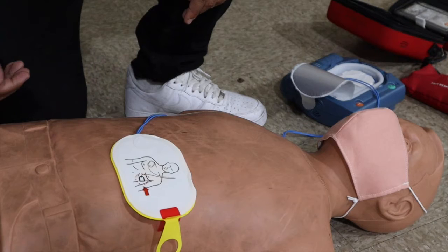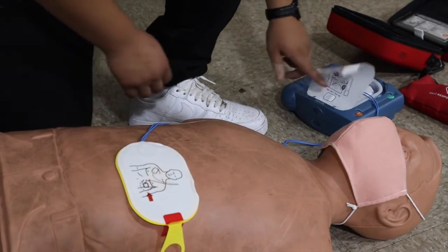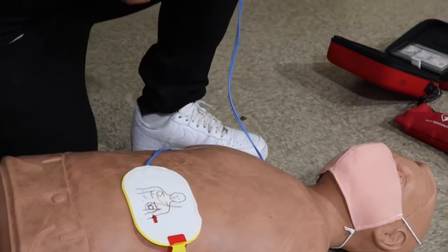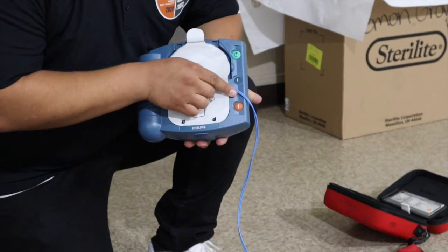Then the defibrillator will scan the body and will instruct you whether or not you need to press the charge. The charge is this orange button right here. Once a medical professional arrives, you let them take over.